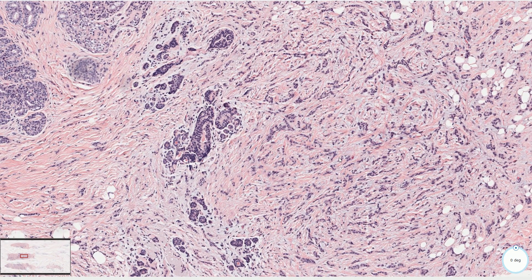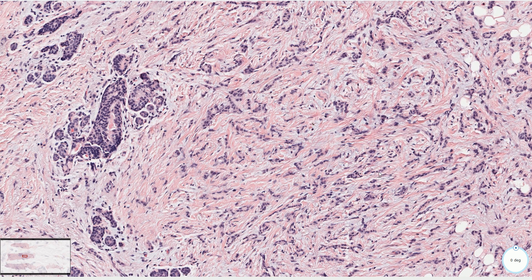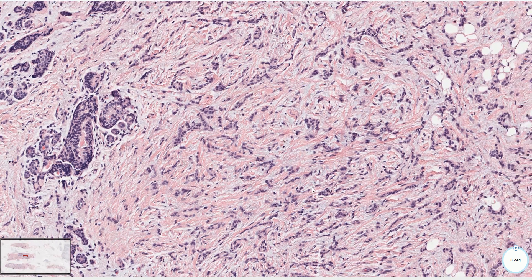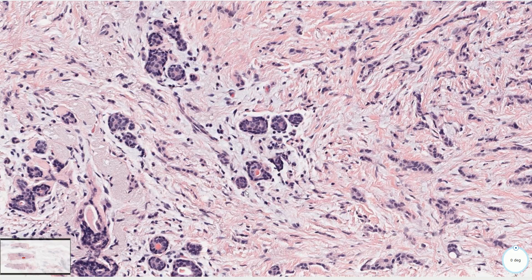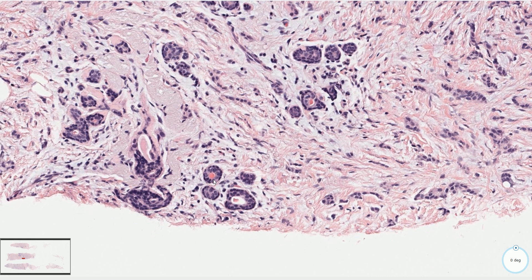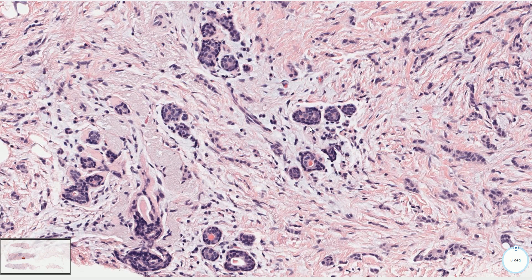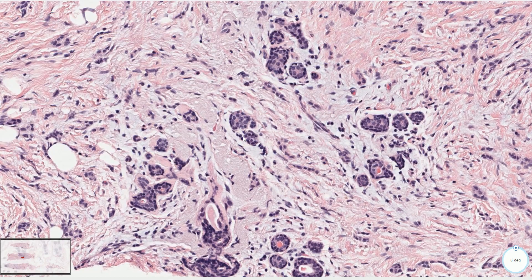This core biopsy is mostly infiltrated by discohesive cells arranged in linear single-file patterns, also called Indian file patterns, and then there is a minor tubular component. These tubules are typically very small and the lumina are almost perfectly round. The cells are relatively uniform and well-differentiated with inconspicuous nuclei. Mitotic figures are rare, and we should not see any angulated or comma-shaped tubules as in tubular carcinoma, which is a common differential diagnosis.